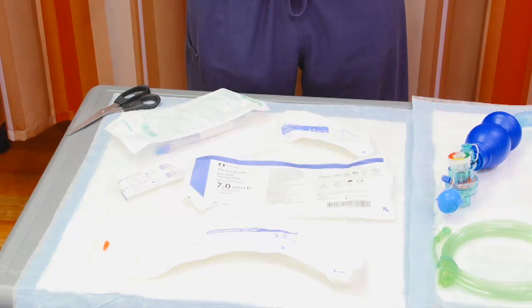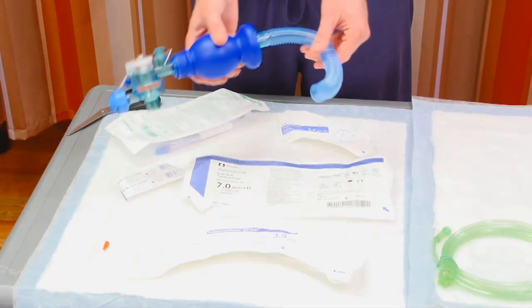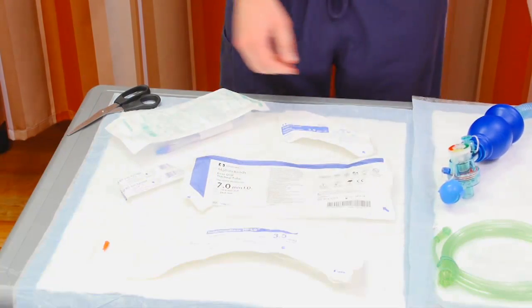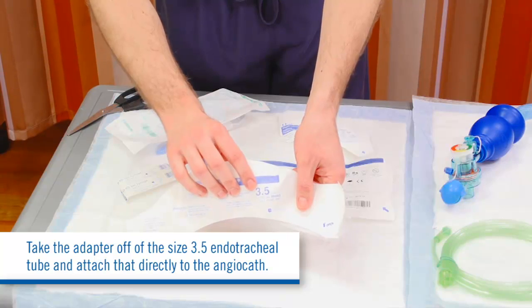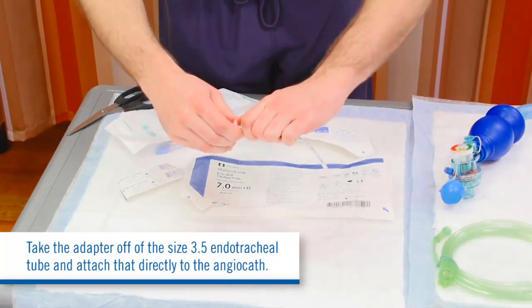There are 3 possible setups for bagging through the angiocath. Sure, you can use high-pressure oxygen tubing, but again, that takes a while to find. Additionally, for children under 5 who have smaller total lung capacities and smaller tidal volumes, bagging is preferred over jet ventilation. So here are the 3 setups. Number 1, take the adapter off of the size 3.5 endotracheal tube and attach that directly to the angiocath.